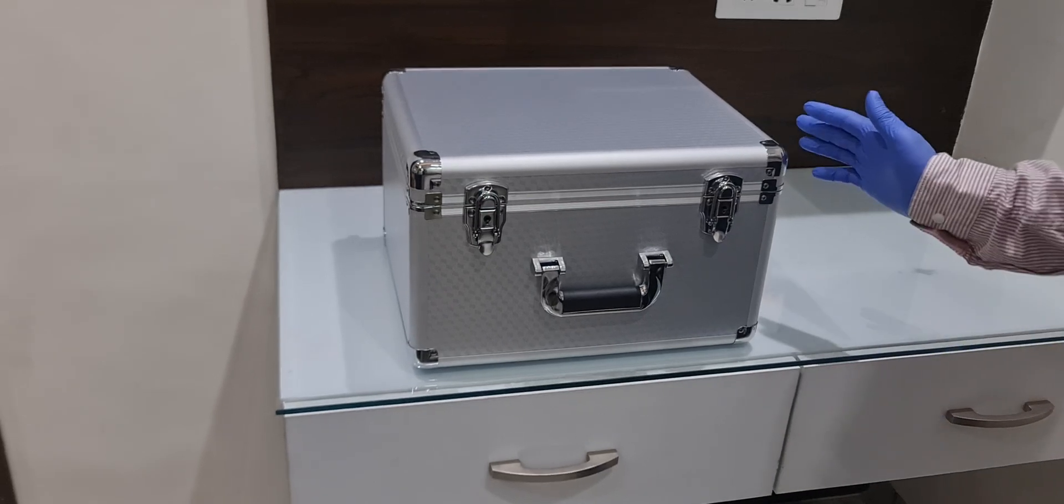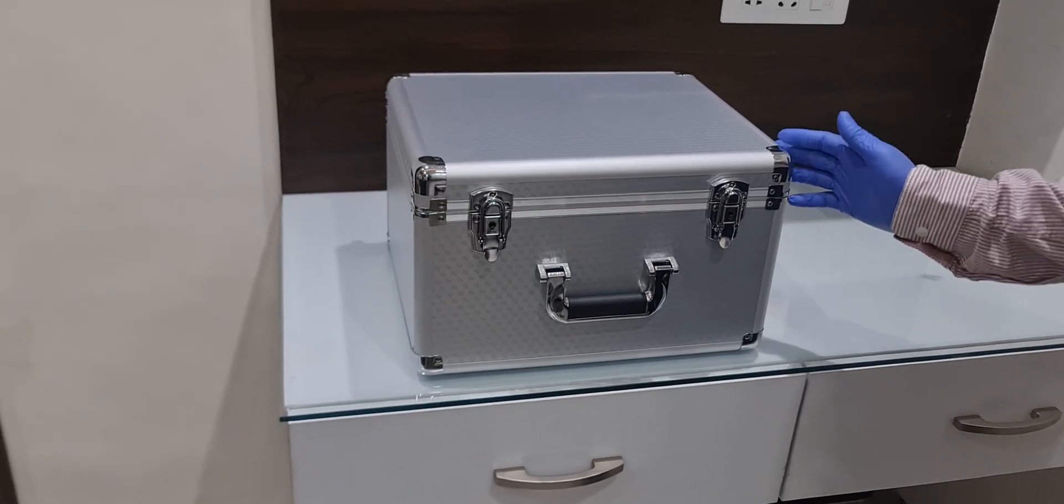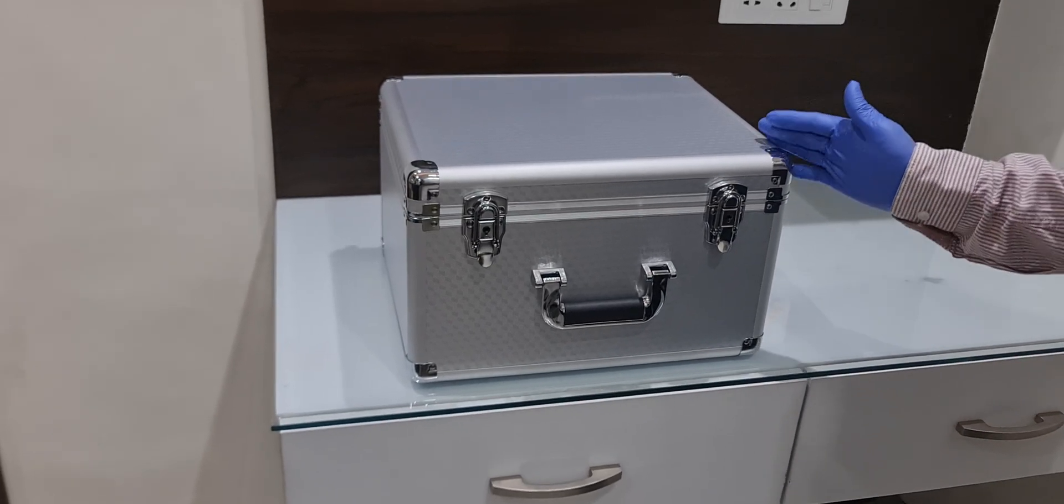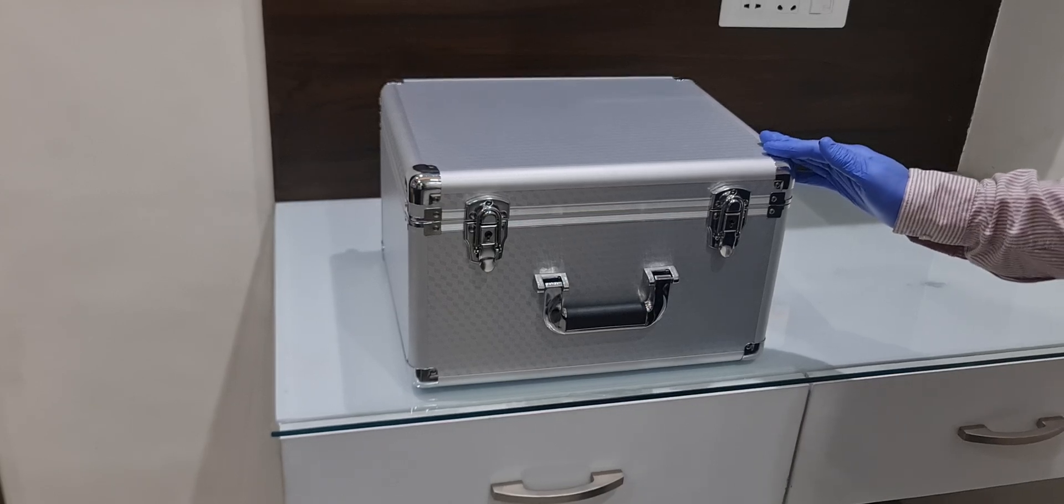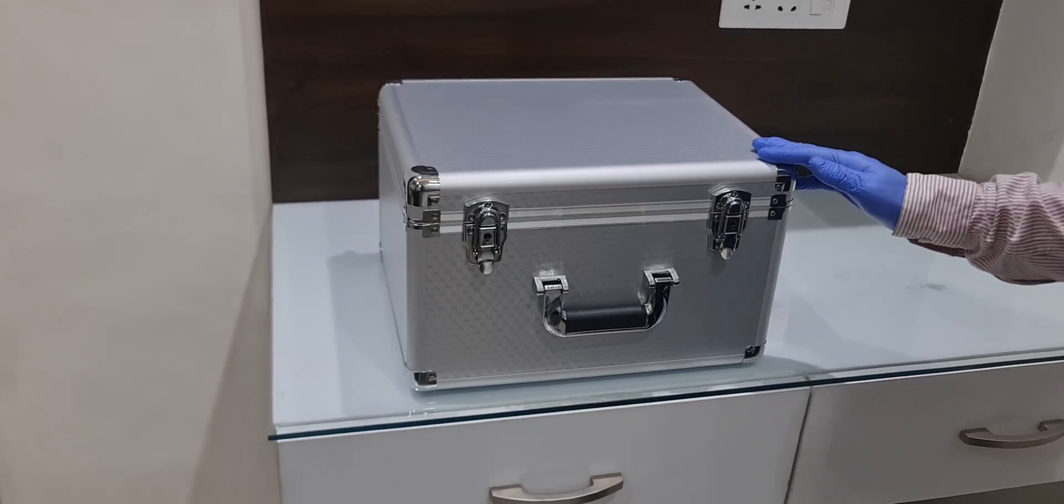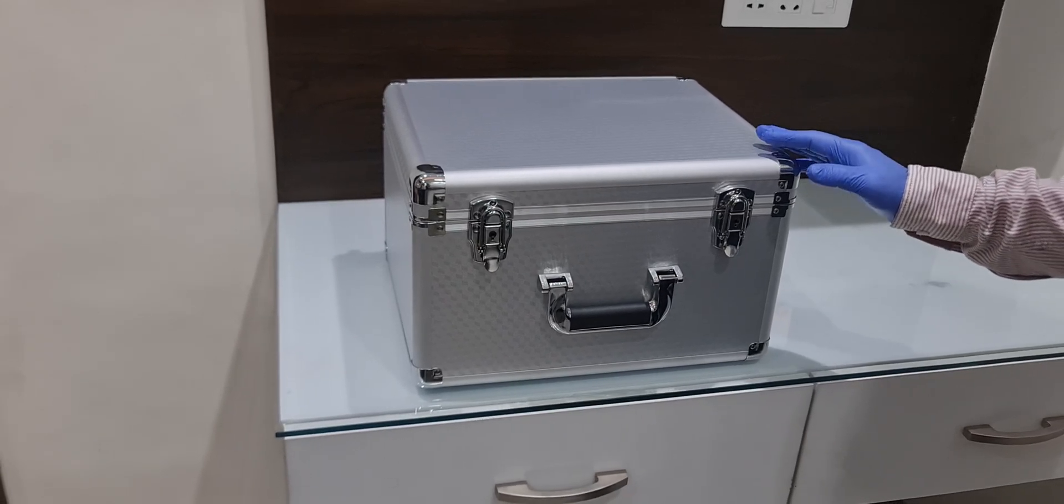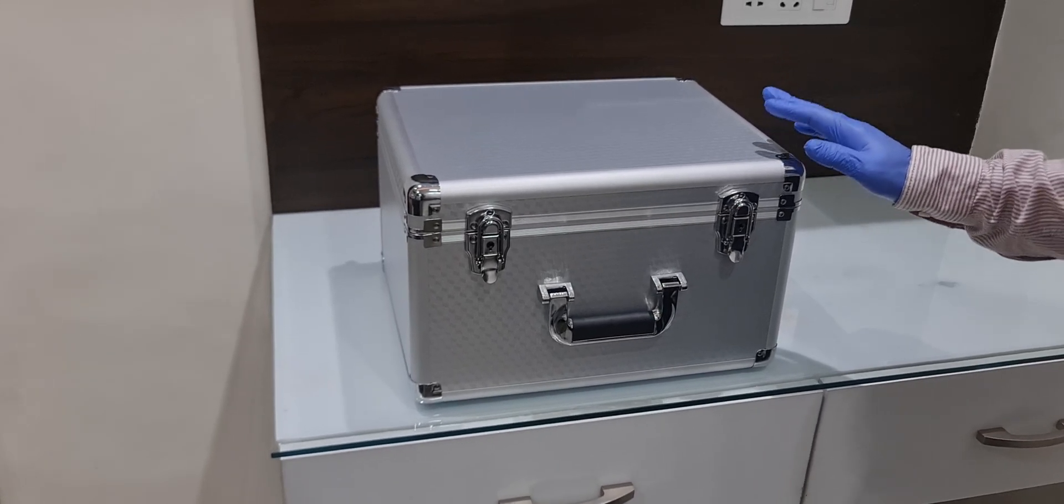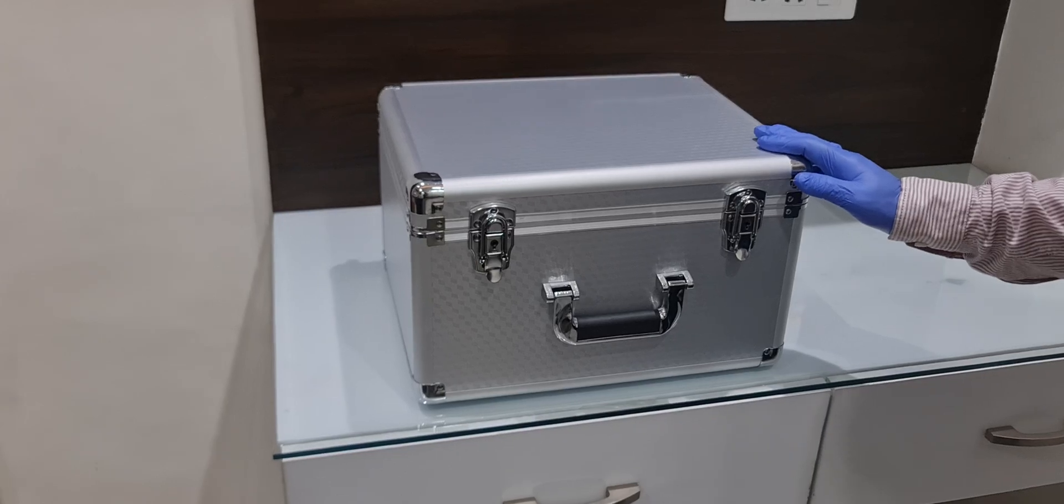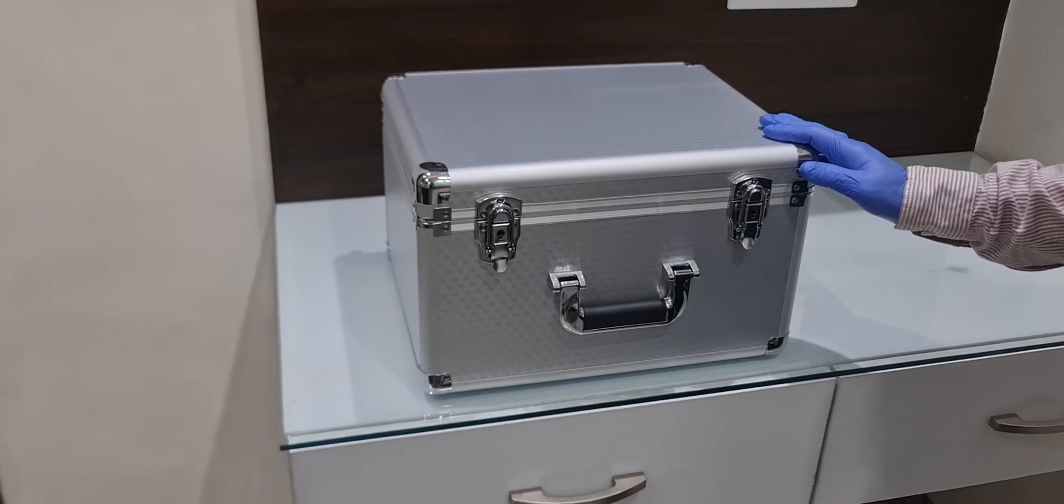Dear Doctors and Dealers, Dentimer launched a new fiber optic implant machine called the Implant Master. I will show you how to unpack and install.